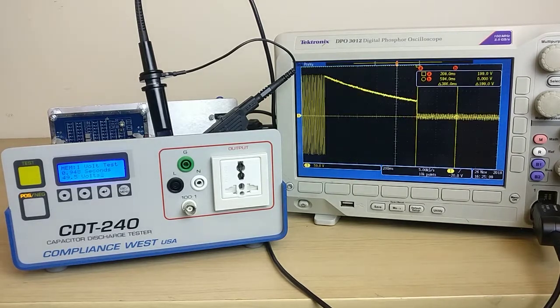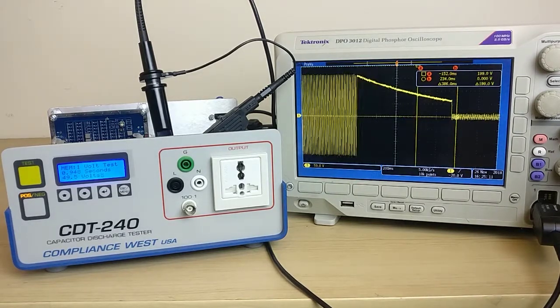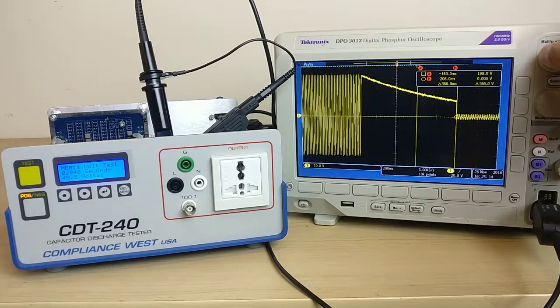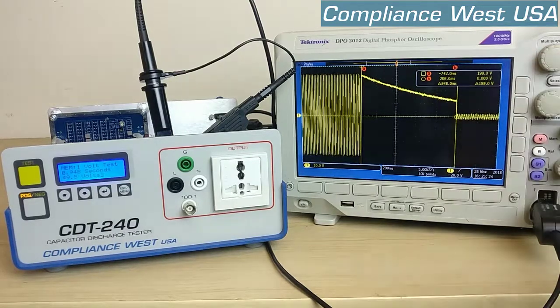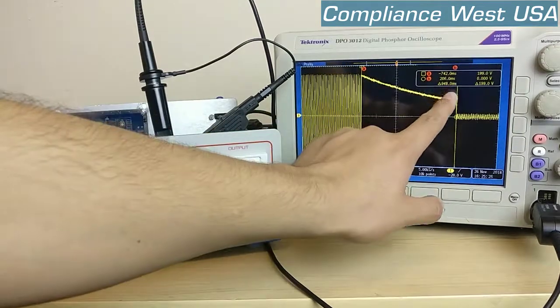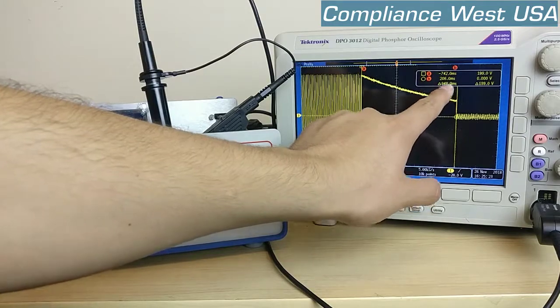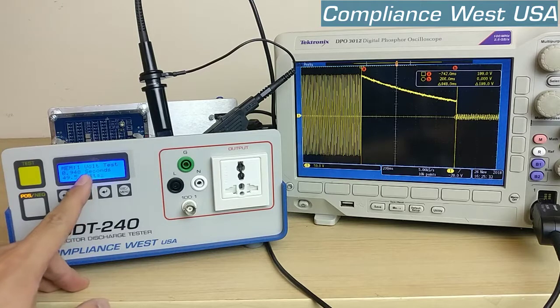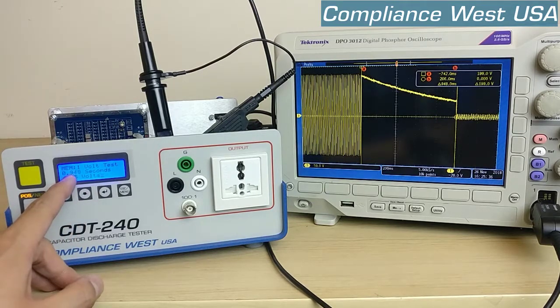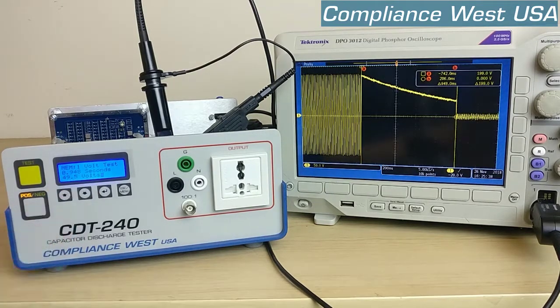Let's adjust the signal and oscilloscope so we can take the time measurement. It's from the start of the decay to the end of the decay. As you can see we're getting 948 milliseconds from A to B and on the CDT we have 0.948 seconds. So that is on point.